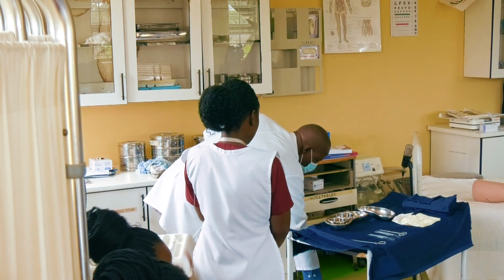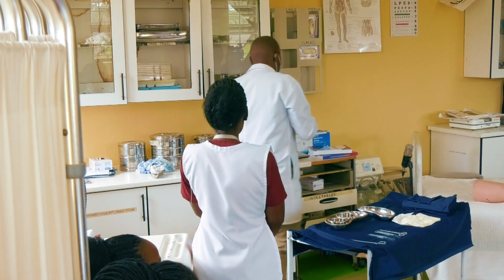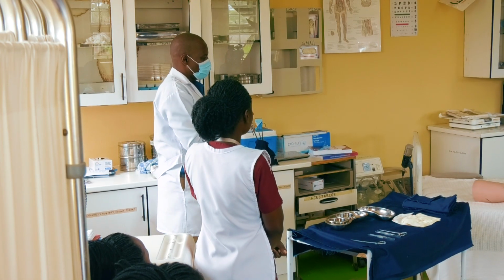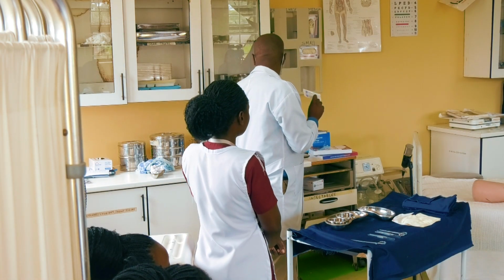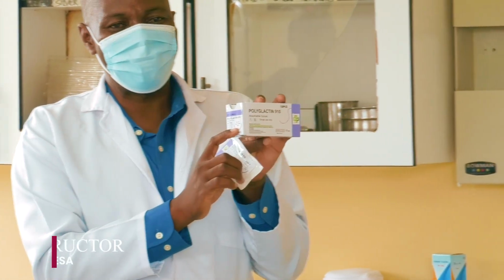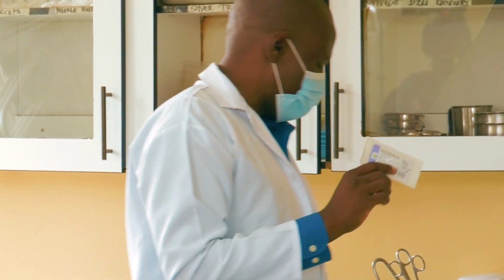Then, did we put the sutures here? Sutures, no. Okay, where's our box? So you get your suture. Since it's the skin, and we've assessed the wound, we are supposed to use silk. Sutures come in different types. For tough tissue, the suture must be on a cutting needle. The skin is very tough, so if you get a round-bodied needle, it will be very difficult for you to suture. You'll be fighting with the patient, you'll be fighting with your sutures. So it has to be on a cutting needle.